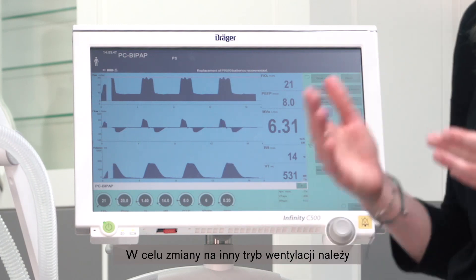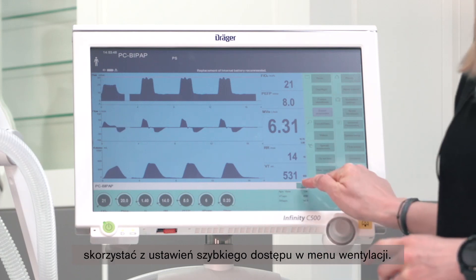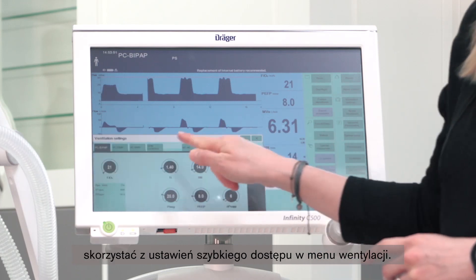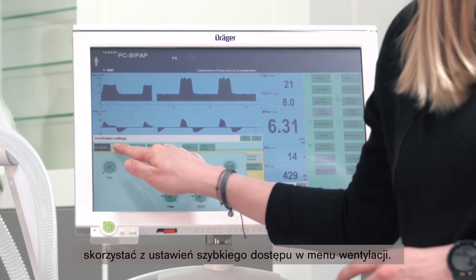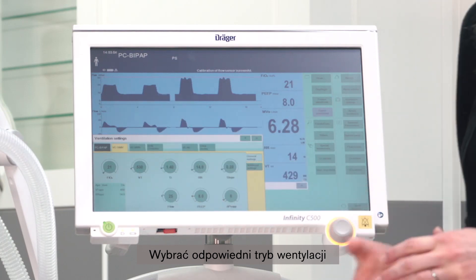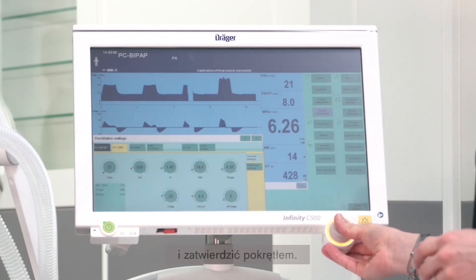If you want to change to a different ventilation mode, use the quick access to ventilation settings, select the respective ventilation mode, and confirm with the rotary knob.